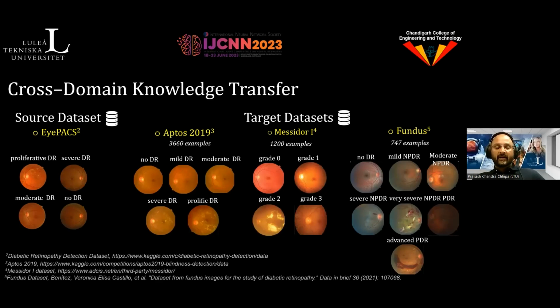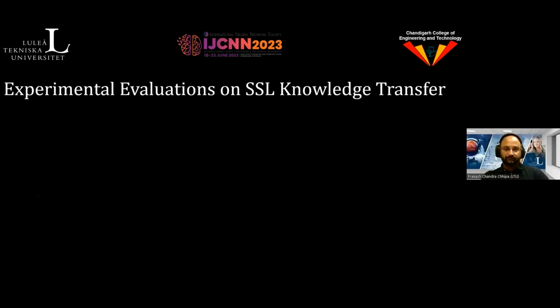This is one of the reasons that learning on these data sets on their own might not be favorable for attaining higher accuracy for diagnosis. So transfer learning is one of the mechanisms, and within that we explore self-supervised transfer learning, because it does not need label information on the pre-training part and does not require human annotation dependencies, which we discussed have several limitations.